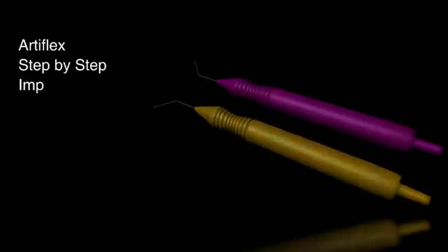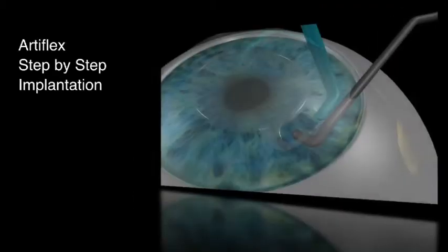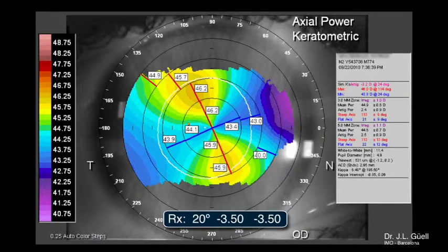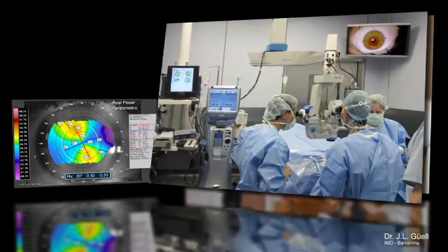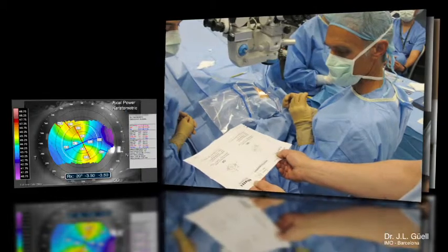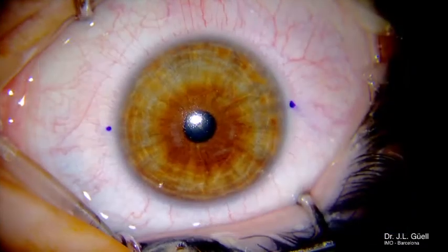The first step in any toric IOL implantation must be the proper preoperative orientation. For that purpose, we first like to mark at the ophthalmometer the horizontal axis, and then, helped by the topography and the information provided by the company, we will precisely orientate the IOL under the surgical microscope.